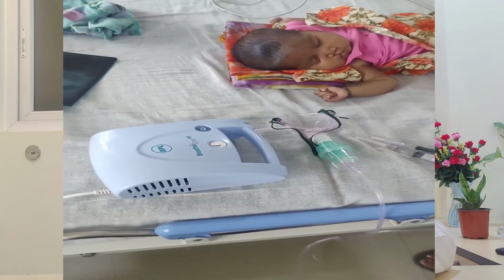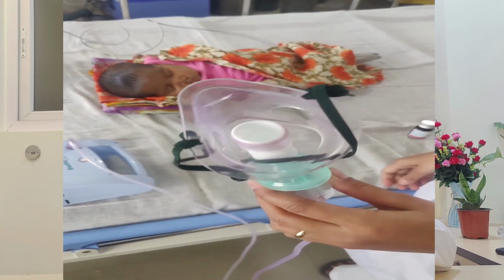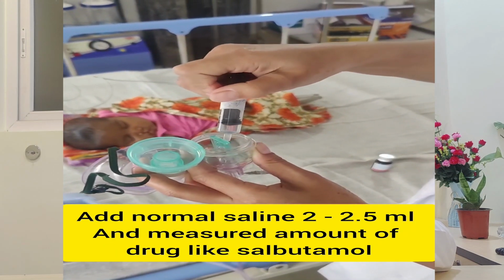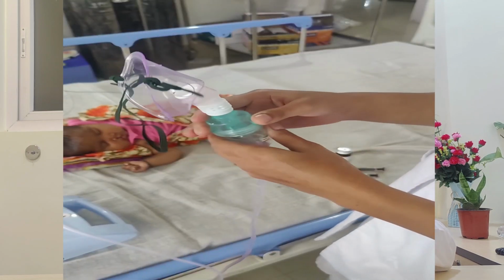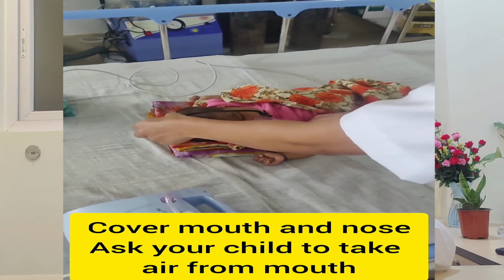So this is the method of using an inhaler device. But for any person and any child, you can use a nebulizer device. How to use the nebulizer device? Connect the compressor machine with the nebulizer chamber by tubing. Add 2 ml of normal saline with the advised dose of medicine like salbutamol or budesonide. Switch on the machine. Look for mist, meaning aerosol coming or not. Then attach the face mask to the child. Ensure it covers the nose and mouth of the child. Encourage the child to breathe with mouth open.